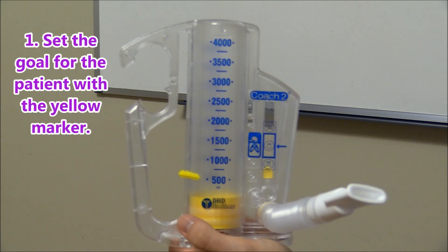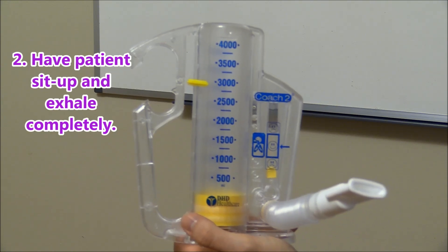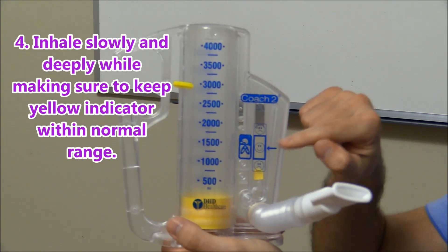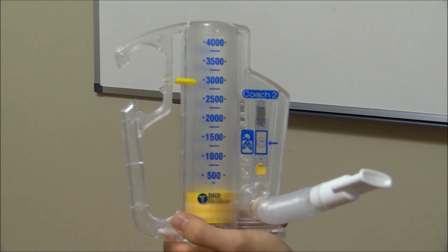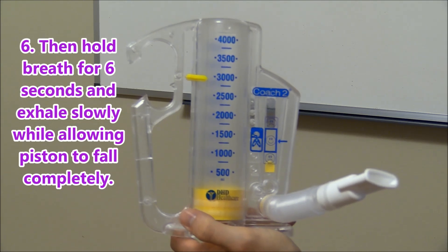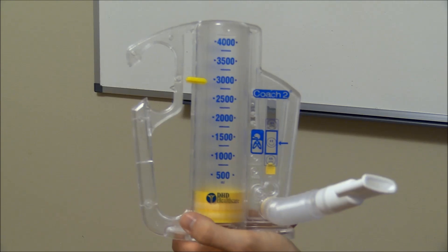Now let's look at the right way to use the incentive spirometer. First, set the goal for the patient using the yellow marker. Have the patient sit up and exhale completely, then seal their mouth around the mouthpiece tightly. They will inhale slowly and deeply, keeping the yellow flow indicator within the normal middle range — not too high or too low. The piston will rise as they inhale as deeply as possible until they can't inhale anymore. Then they hold their breath for six seconds, exhale slowly, and allow the piston to fall before repeating. They should perform this at least ten times every one to two hours while awake.